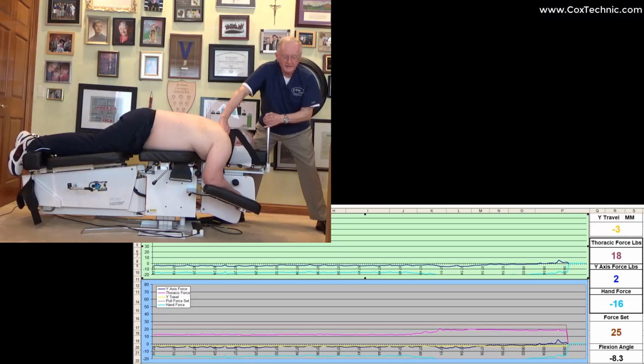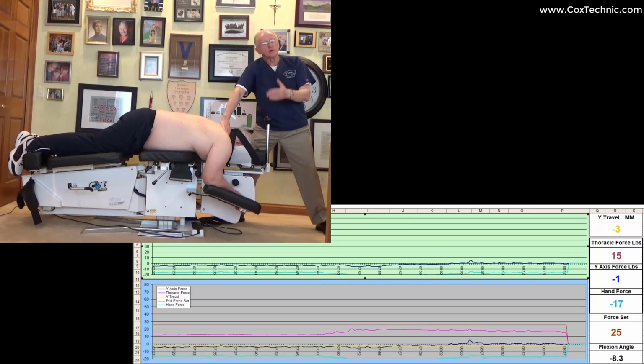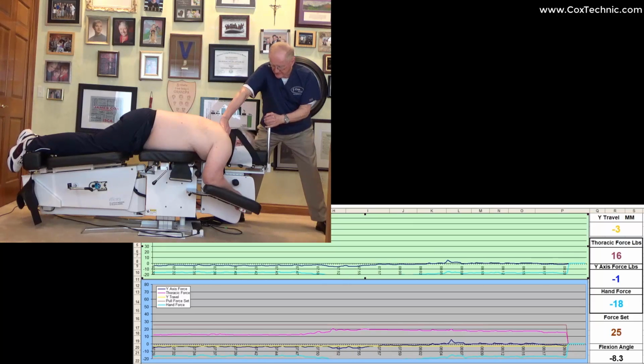So I'm applying a caudad contact to the 3 discs as I apply my 5 4-second pumps, and repeat 3 20-second distractions.